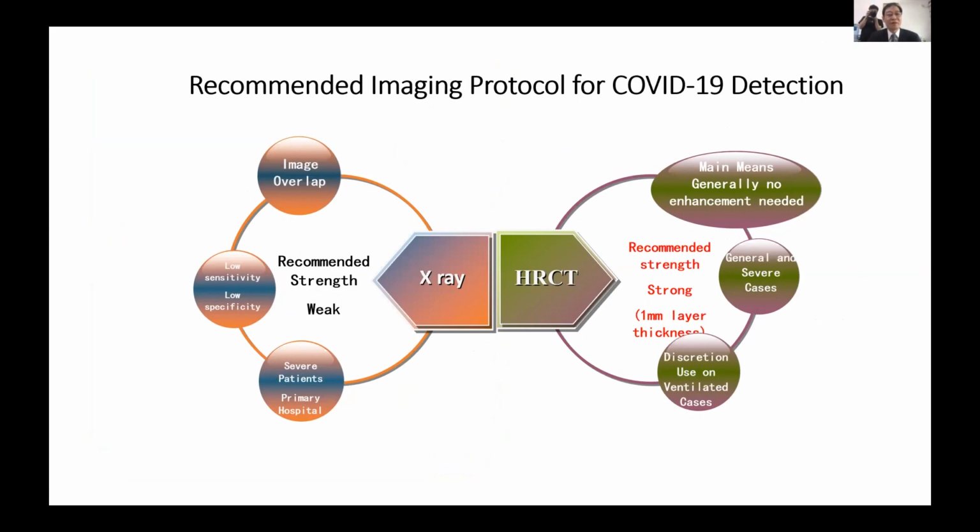We complete the imaging protocol for COVID-19 detection: a thin-section CT scan with 1 millimeter layer thickness.